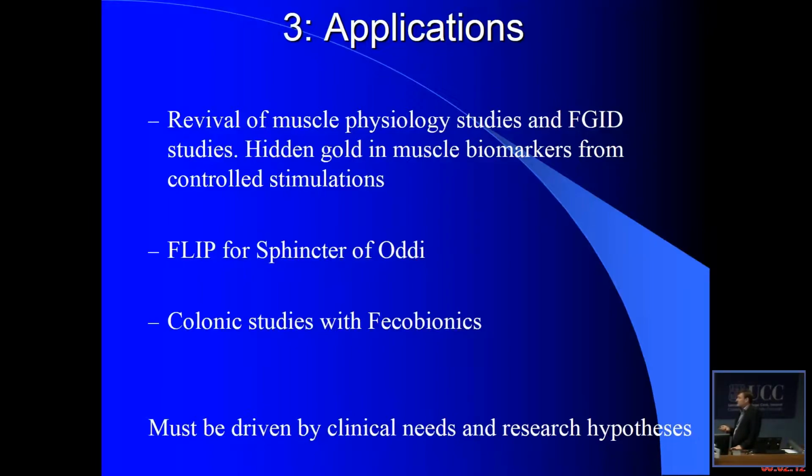For applications, I would definitely see an application for FLIP in sphincter of Oddi. I think there's been 1 or 2 studies published, but there's definitely room for more, but it would require custom designed probes again. FLIP has already moved into the anal canal, the pyloric sphincter. You would find studies there, so sphincter of Oddi could be a future application where it could be useful.